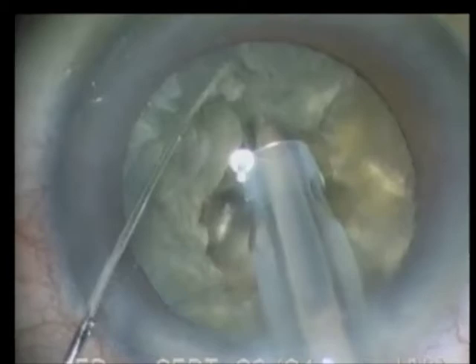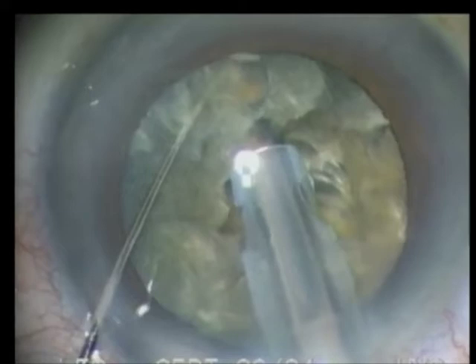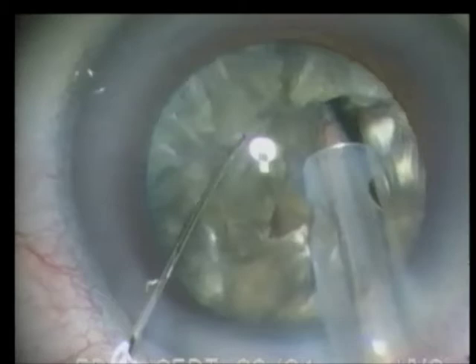Just short bursts of ultrasound and then maintaining aspiration only are used for holding onto the segment for the phaco chop and separation. As one turns the lens, if there's some thickness in the posterior pole, this can be shaved thinner with the bent Kelman tip as we see occurring right here.